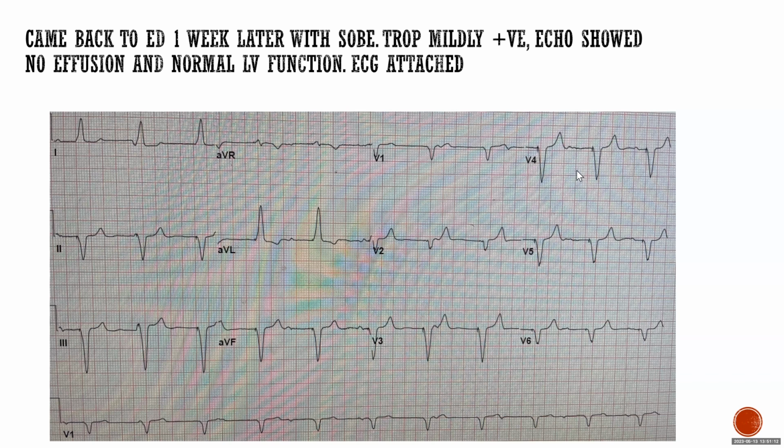Yeah, actually there are spikes. I agree, not all leads, but you see here V4, V5, V6, V3. Some leads don't show spikes well, but there are spikes. So there's good capturing, but not sensing. Capture, undersensing, pacing the ventricle only.